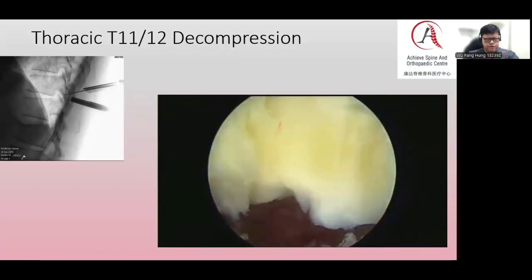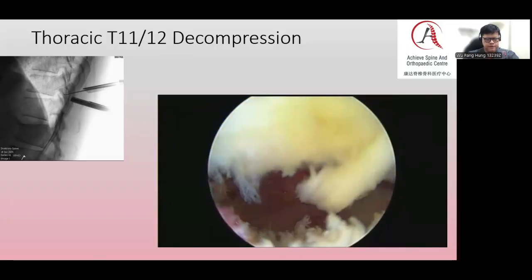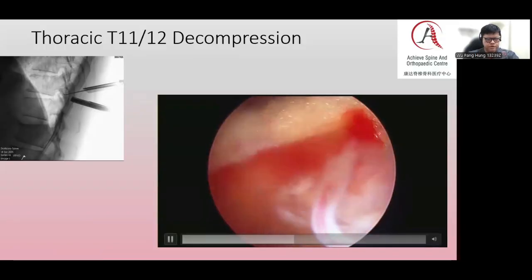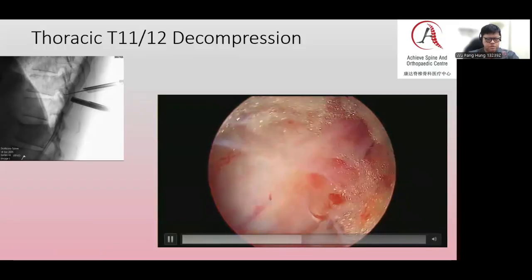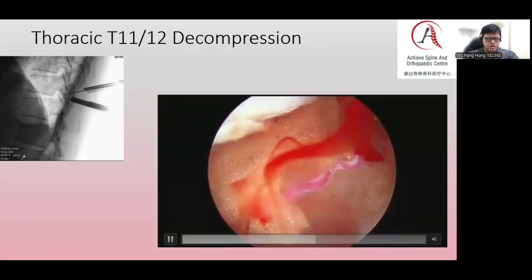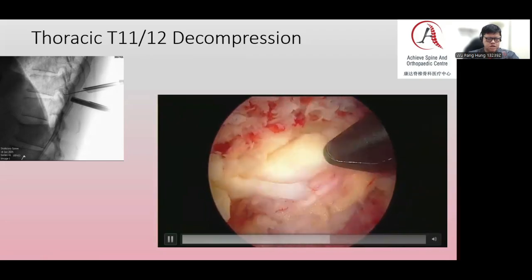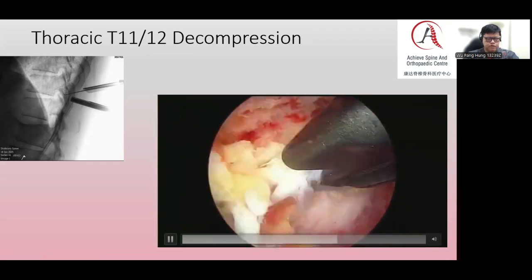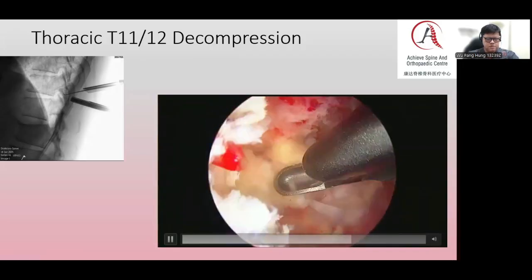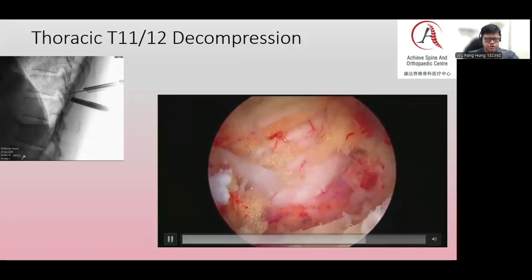From the right side, we can remove the flavum of both sides, as well as that of the facet joint. I find the reason I stand on the right side is that there's extensive facet hypertrophy on the right side. Unlike lumbar spine, I don't really like doing crossing over of the spinal cord to decompress the opposite side with the worry of touching the spinal cord. So we tend to decompress starting on the right. So we can also remove the central and lateral recess stenosis of the left side. You can see that I'm removing the left side flavum now. The left side stenosis is moderate, so there's less emphasis of decompression.